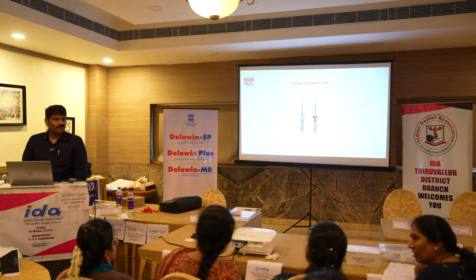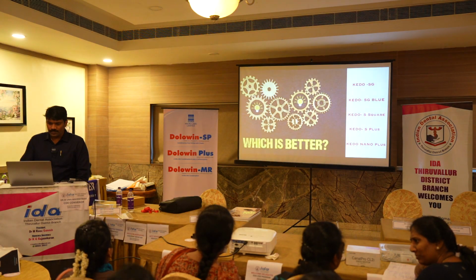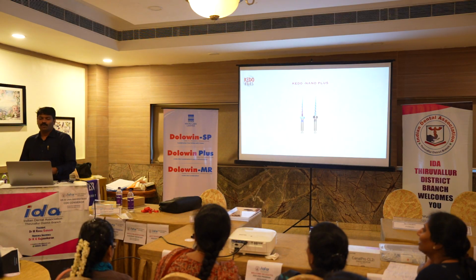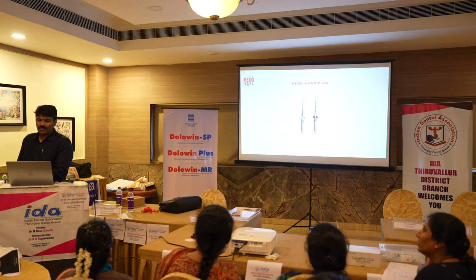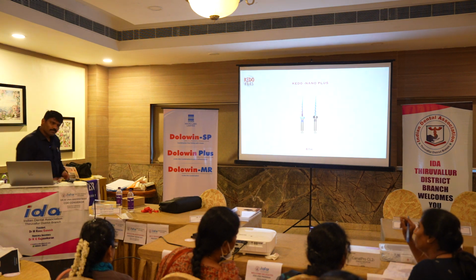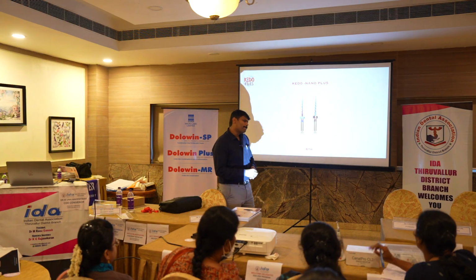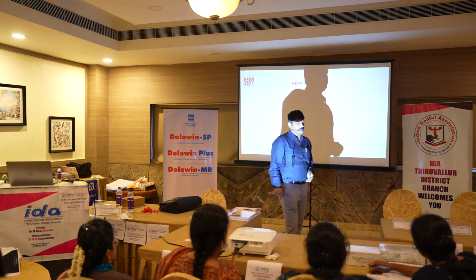Any doubt here with rotary? This is the 6th generation. Any doubts? I'll go through it because now you are confused about which system to use. I'll tell you what it is. A 15 size file is more than enough to take it.